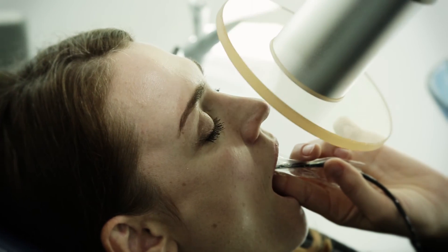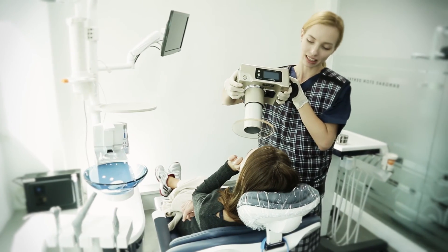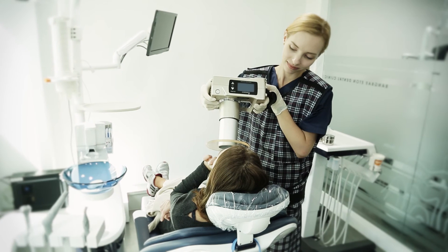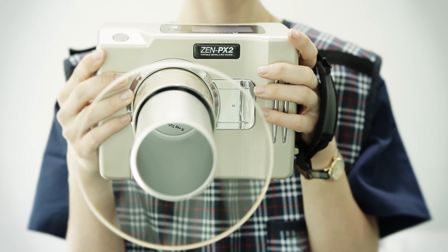If a problem occurs related to the program, please check the manual book you have received. Other than that, please contact Genaray. Portable Dental X-Ray System Zen PX2.